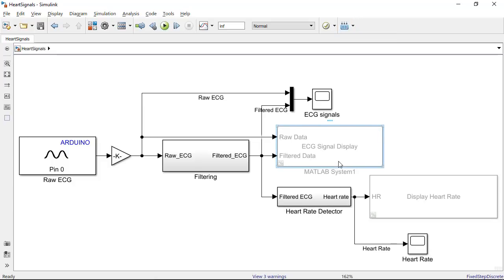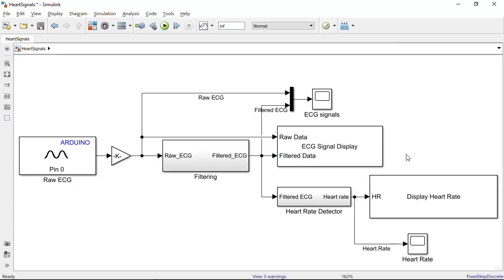So the video that we saw in the slides was using this Simulink model with these two blocks being uncommented. What these blocks do is they are using existing libraries to program the TFT screen and display the signals and the heart rate respectively.